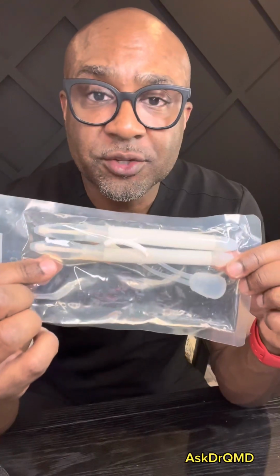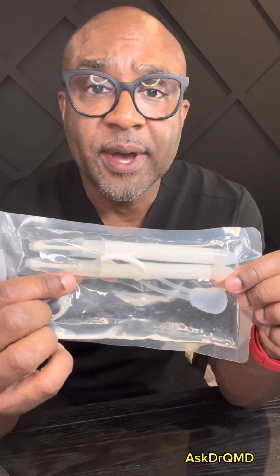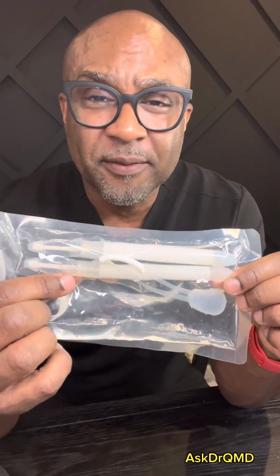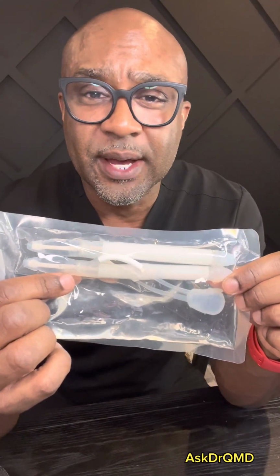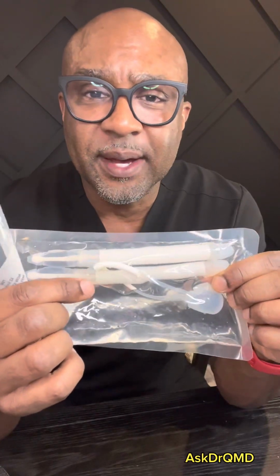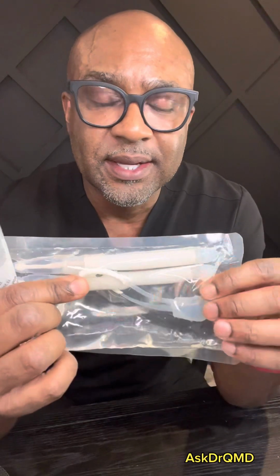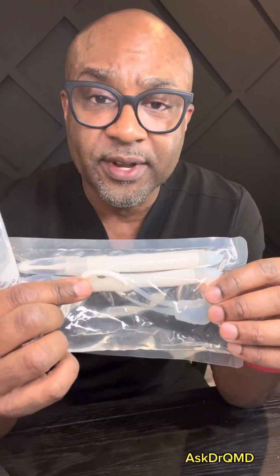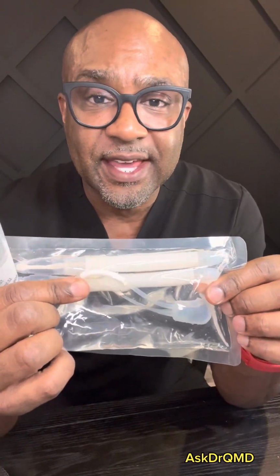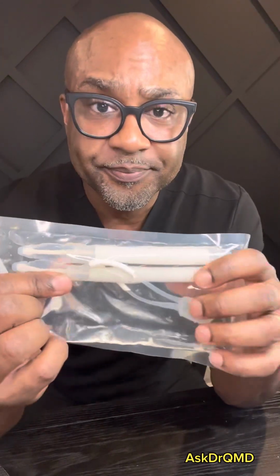Men I choose this prosthesis for are men who have had pelvic surgery, radiation, or inguinal hernias with mesh, basically difficulty entering that space of Retzius right behind the pubic bone in front of the bladder. If that's the case, then this is the perfect prosthesis for you.